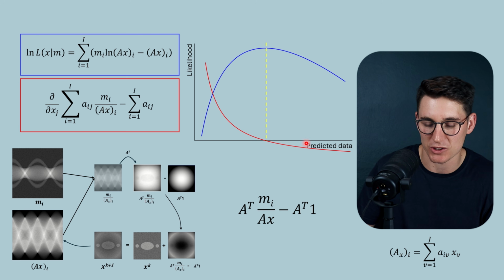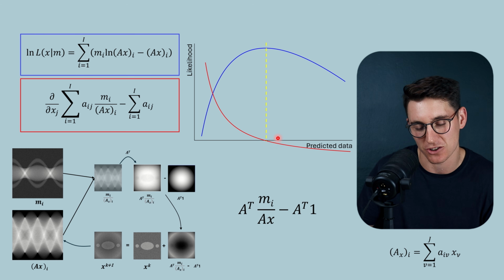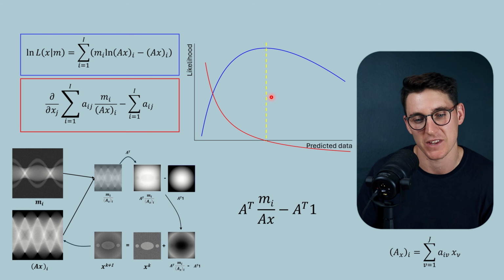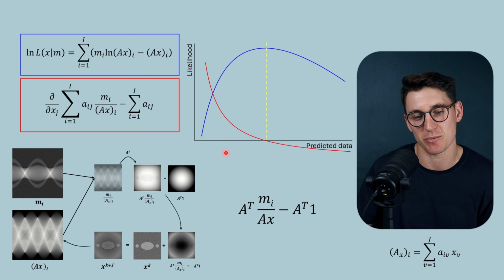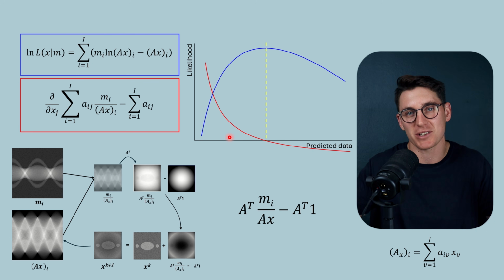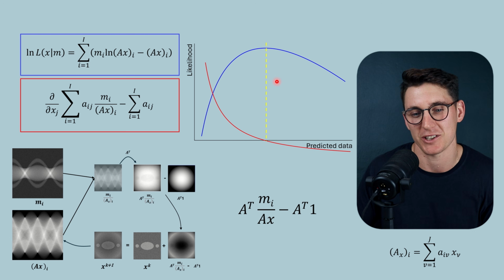If the gradient of the predicted data was here, we'd see the gradient is negative. If we were to add a negative onto our initial estimate, it's going to bring us closer to this MLE. You can see how adding this gradient image to our initial estimate is going to bring that predicted estimate, that predicted data, closer to the maximum likelihood estimate on our log likelihood graph here.